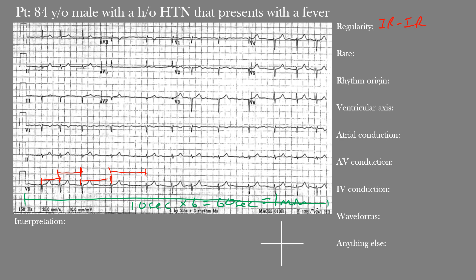Counting across the strip: 1, 2, 3, 4, 5, 6, 7, 8, 9, 10, 11, 12. So 12 complexes times 6 equals 72 beats per minute. The EKG machine also gave the same rate — 72 beats per minute — showing how this method gives a really good estimate. In this case it was exactly the same as the machine.